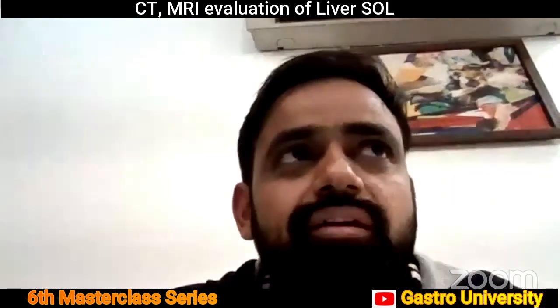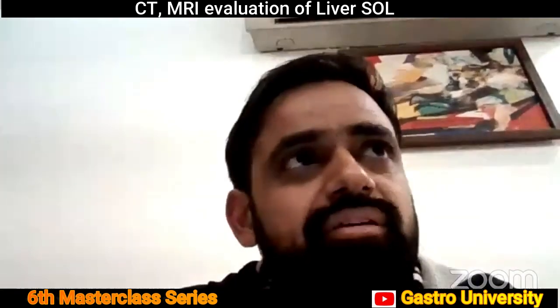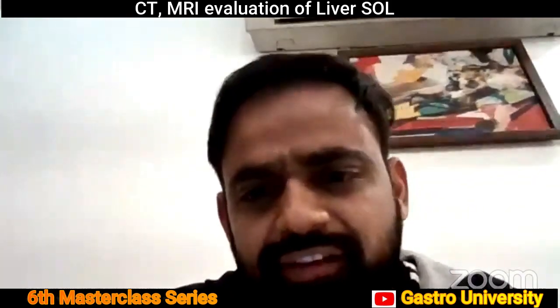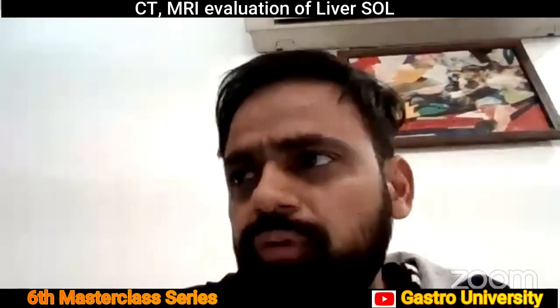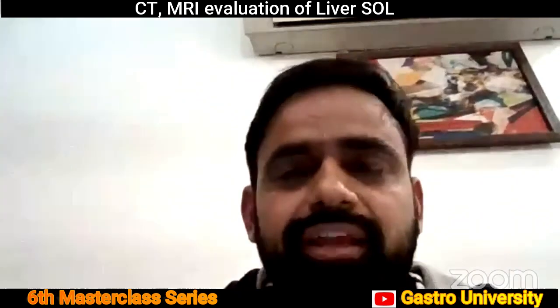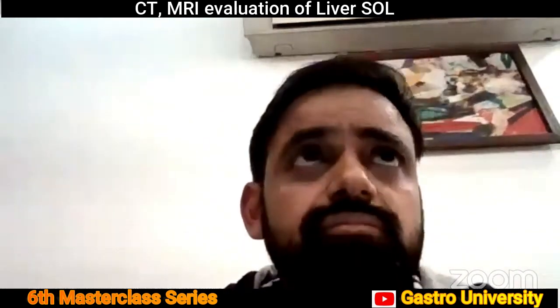So I would say that in the benign lesions, specifically the patient does not have any background liver disease, patient does not have any other primary lesions, and if this lesion is a solitary cystic small lesion with imperceptible wall, then we should stop. We can follow up the patient. Okay, that this is definitely confidently a cyst. So for the solitary small simple cystic lesions, we do not require any further imaging.